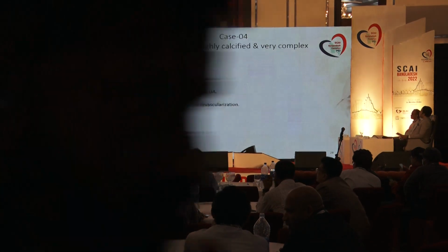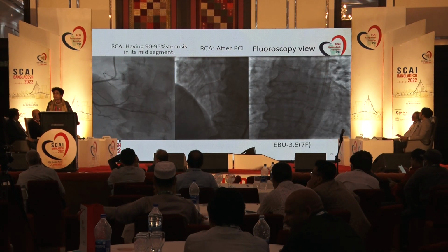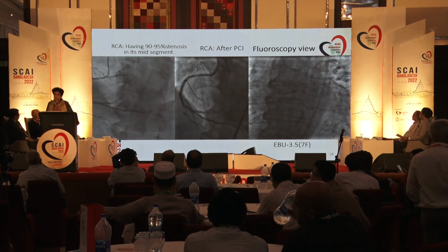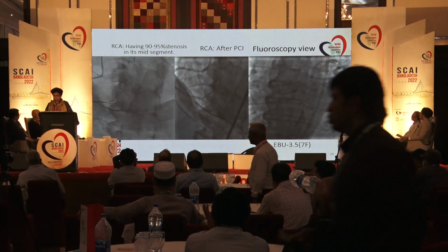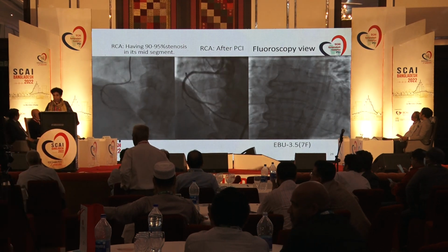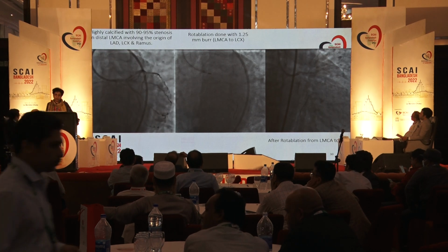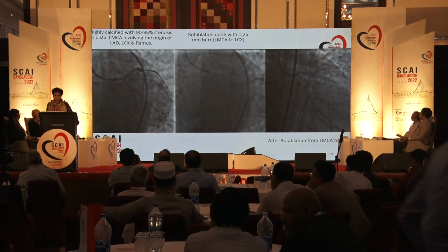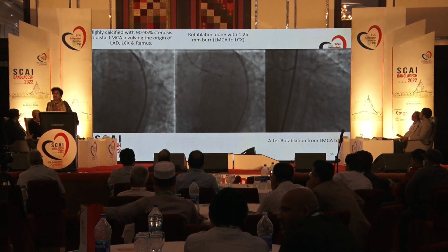Now, this fourth case, an 82-year-old, very frail lady, triple vessel disease, heavily calcified vessels, refused surgery because of the multiple comorbidities. Here we staged the procedure because of her frailty. We did the RCA first, and only 4 to 5 days later did we tackle the left side. And on the left side, we knew from the very beginning that she would not tolerate any prolonged procedure, and this calcium would require rotablation, and also this bifurcation lesion was so complex it would require an upfront double stent technique.